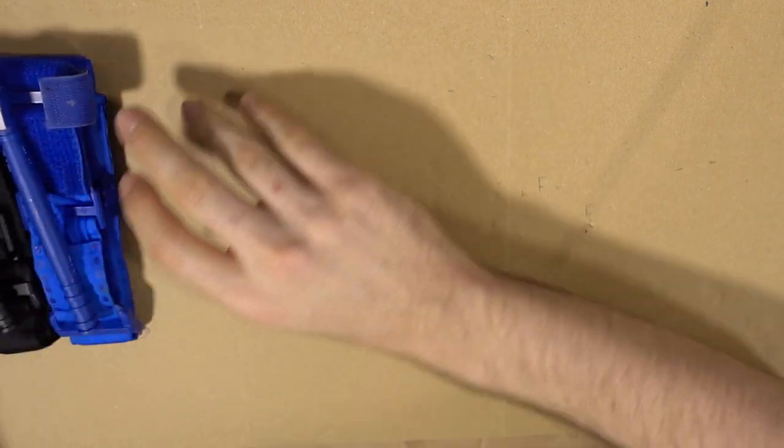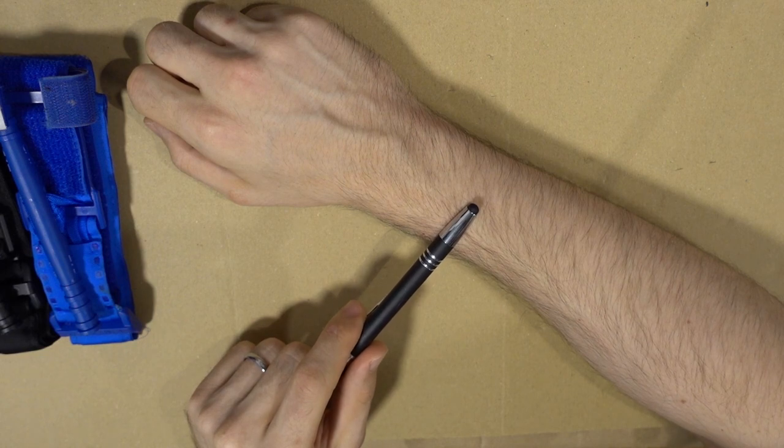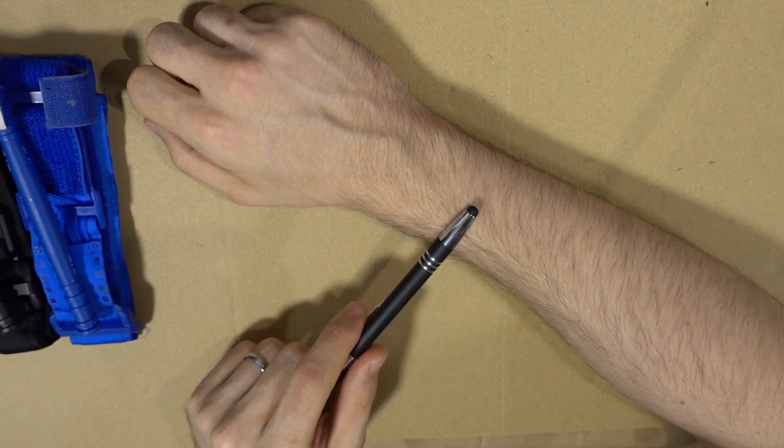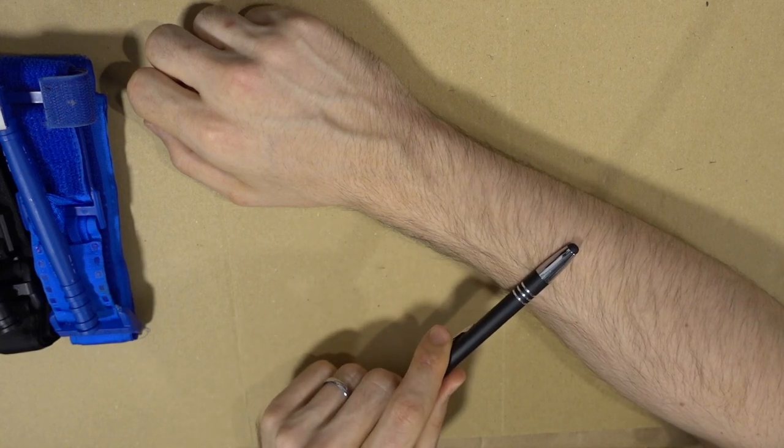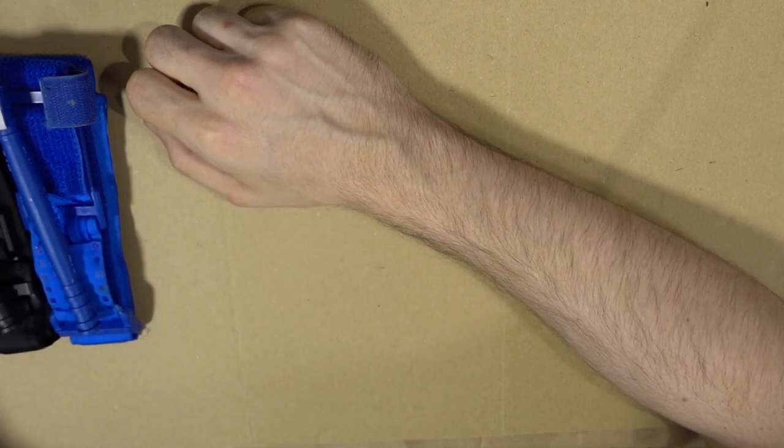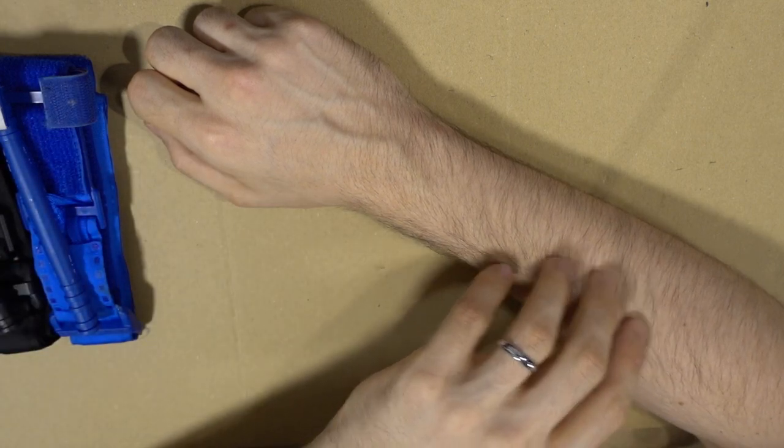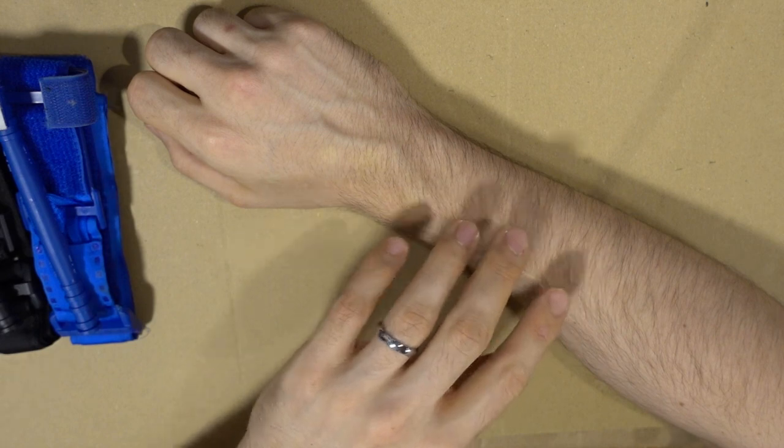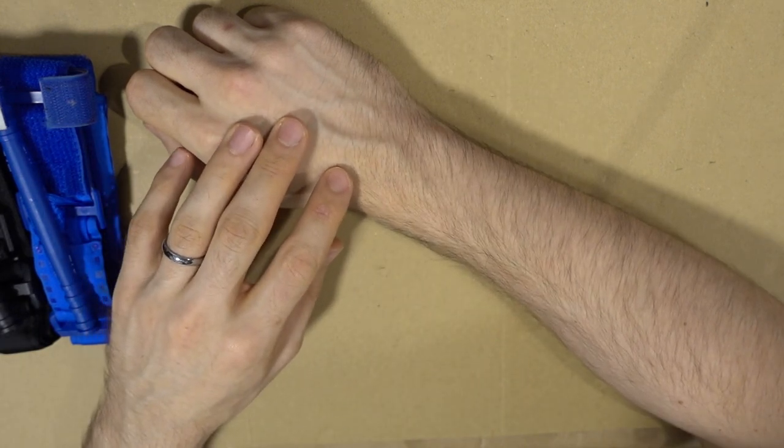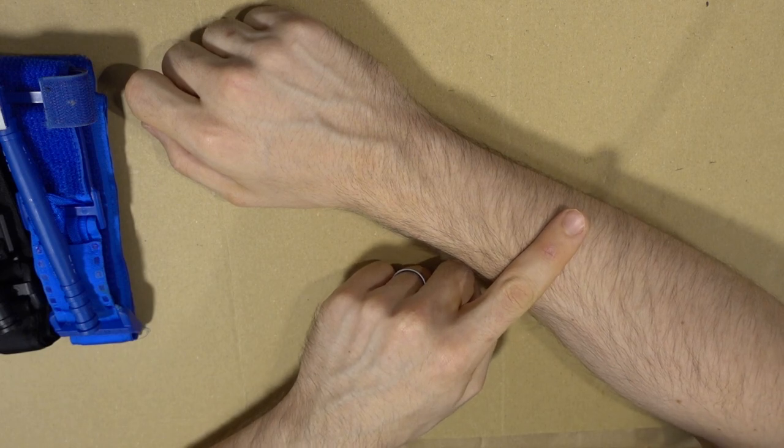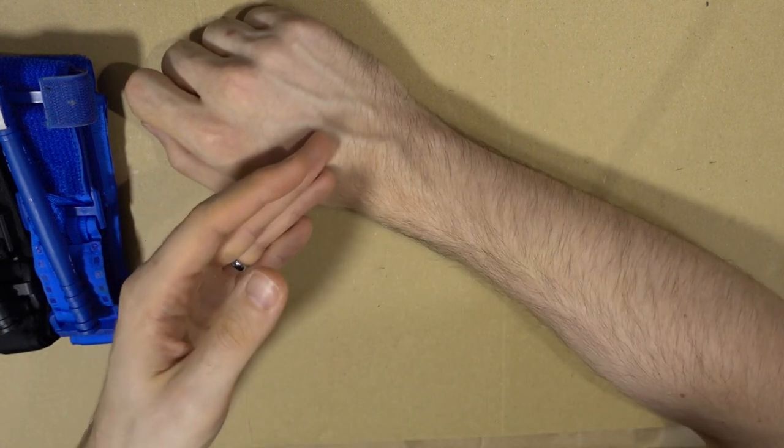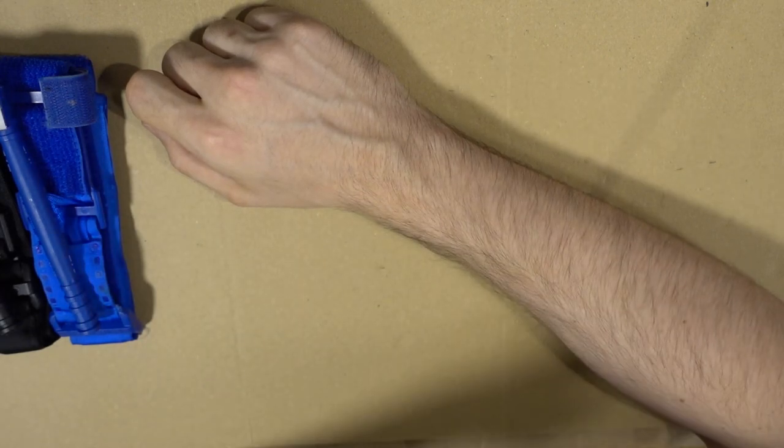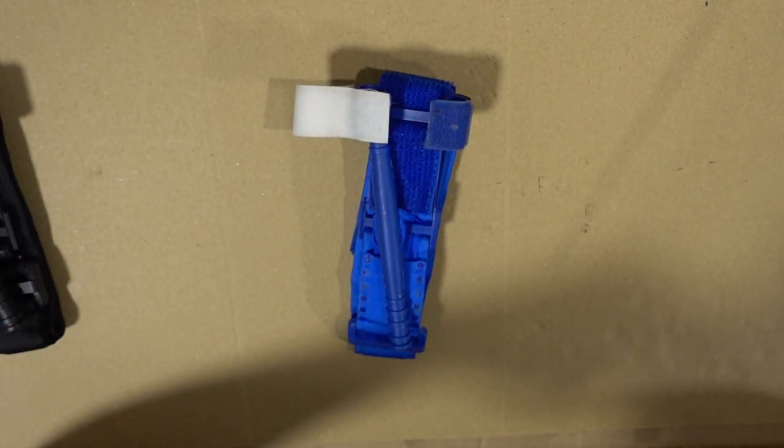Let's assume you see the wound is here. Most of the resources or people say that you just apply it slightly above the wound. The reasoning here is that because you're constricting all the blood flow, you might get nerve damage after some time, and by only applying it right above the wound, you're not jeopardizing nerve damage in the whole arm or leg.